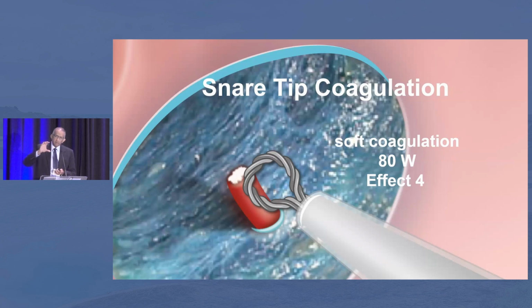So one thing that I've changed is in the electrosurgery setting that I use, the Erbe machine. On the left side is my cut, on the right side is usually forced coagulation. So when I'm doing EMR, I change my forced coagulation setting to soft coagulation up front so that I don't have to change my settings. By having my soft coagulation, I'm already ready with my setting. I'm not changing in the middle of the procedure. All I have to do is ask the assistant to open up the snare tip and then use the blue pedal to deliver the current and take care of the bleed.